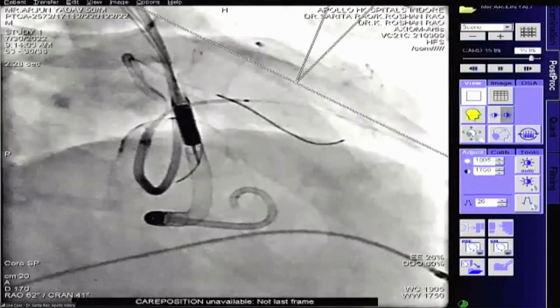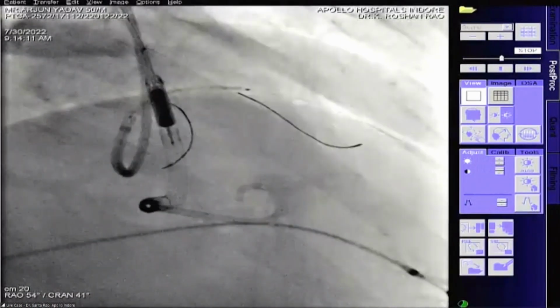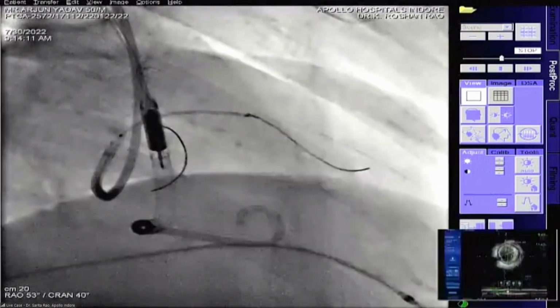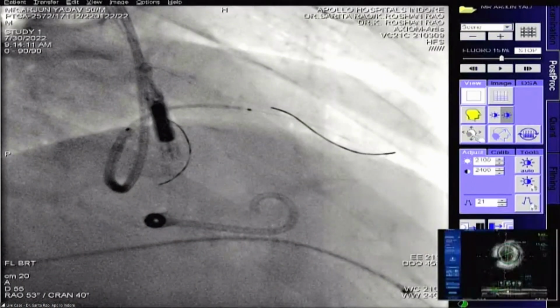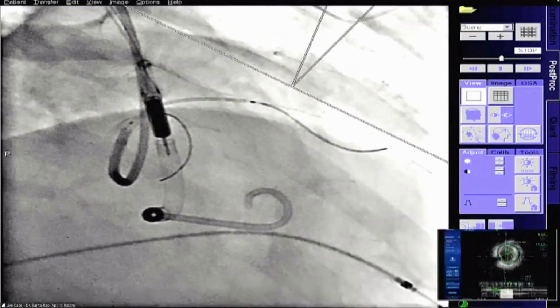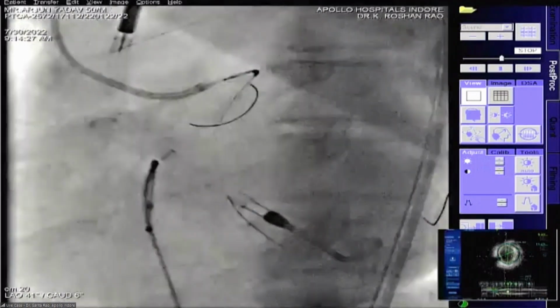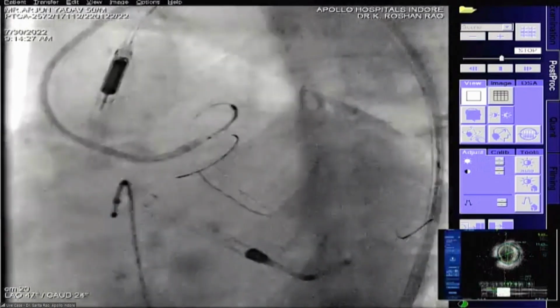Srinivas, one would certainly like to see the caudal also. Yes, you can see it, or AP caudal. Measure the final ostial placement, sir. Yes, sometimes it has to be in cranial. Yes, I agree. Caudal. Center it, please.